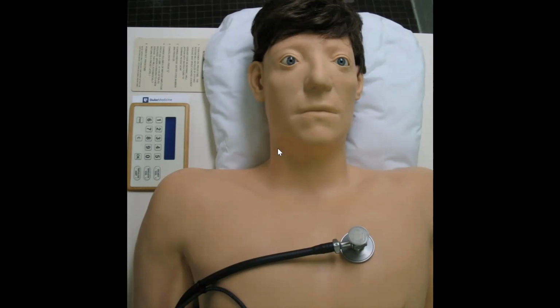So we will enter the station, say loudly your name and GMC number, and you will verbalize that you take all universal precautions. Then you will go to the patient. Hello, introduce yourself, confirm the patient name and age, and then ask what brought you to the hospital, how can I help you? He will tell you, I can't breathe, doctor.